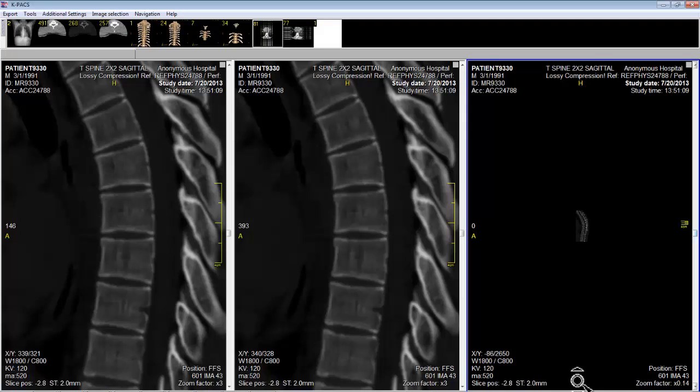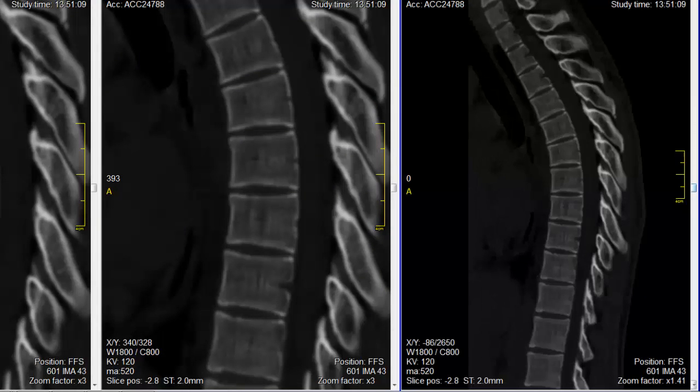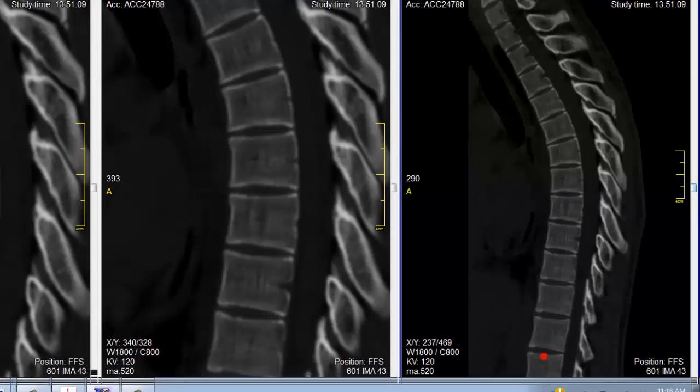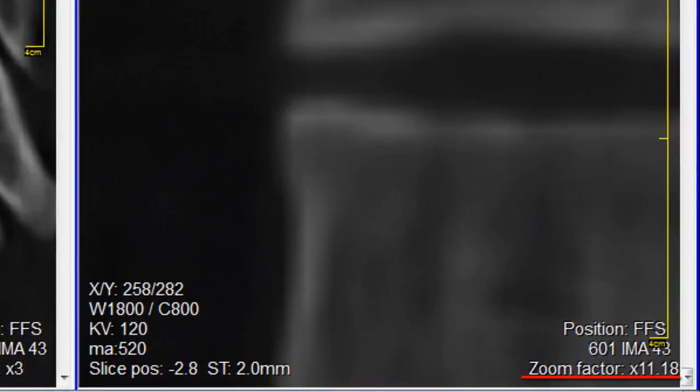You can look at your screen and read what the zoom factor is in the bottom right hand corner — it's displayed right here. So we have a zoom factor of 0.14. If I move my cursor up I could change my zoom factor to 11.18.